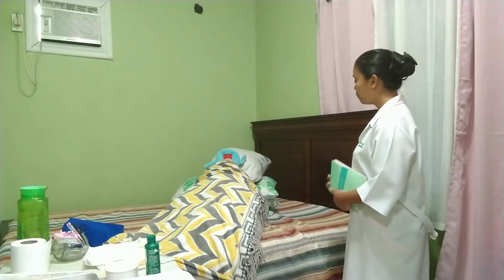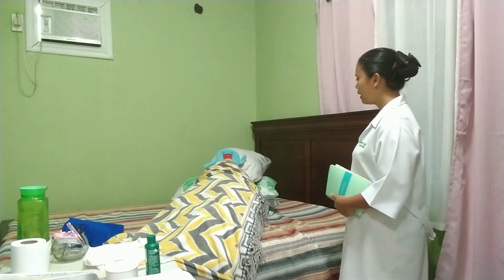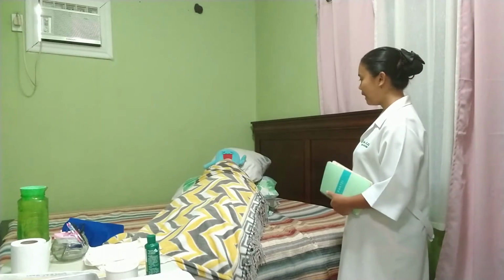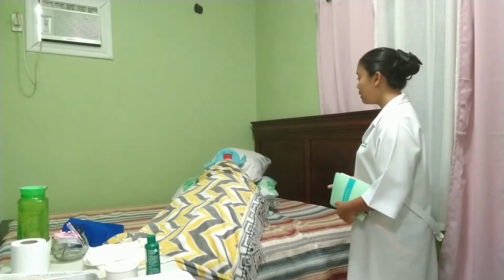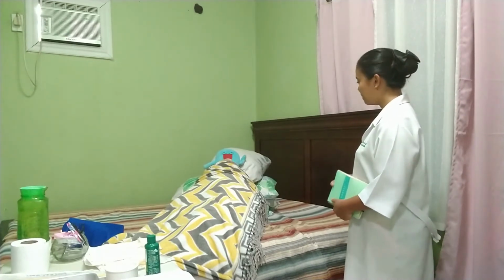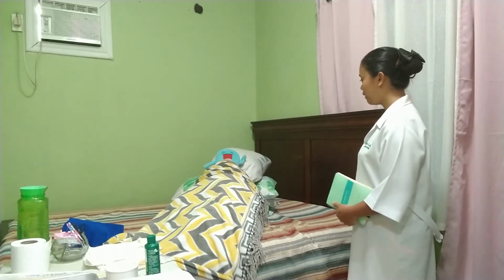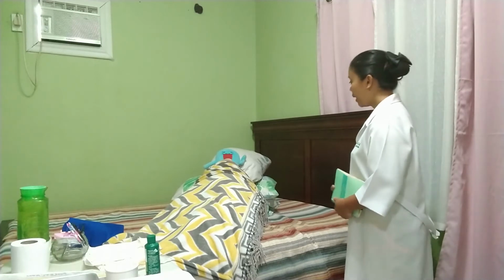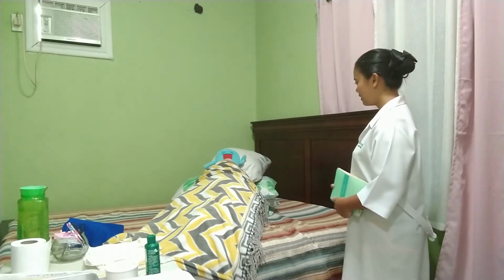That is to help you feel better because of the distended bladder that you have, and so we could decompress the urine that's trapped in your bladder. Now, this procedure will be a little bit uncomfortable, but deep breathing will greatly help us to alleviate the pain or alleviate the discomfort later on. Do you have any question, Miss Angelina?